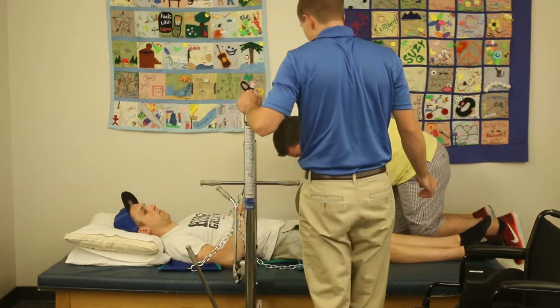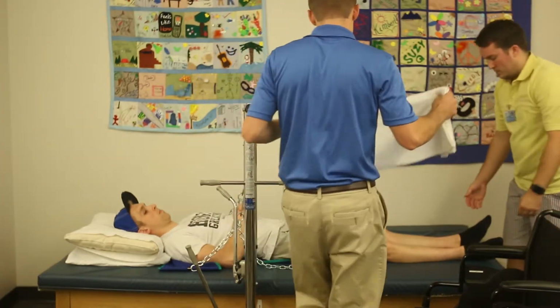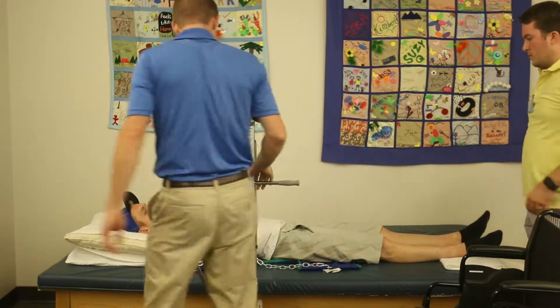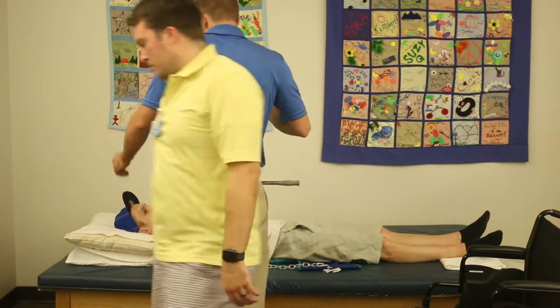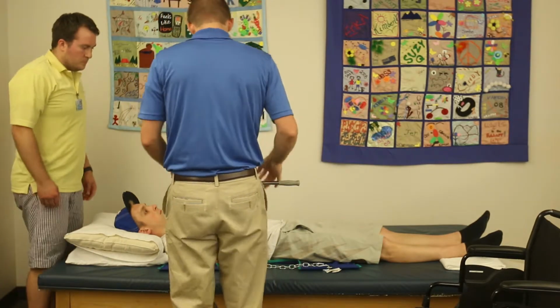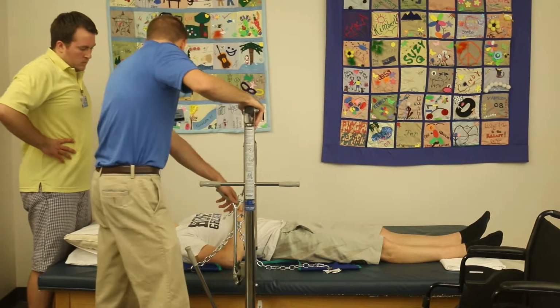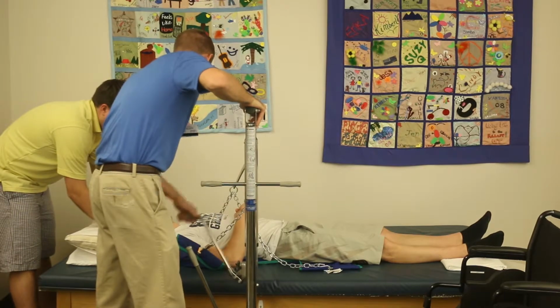We don't have your shoes on right now, so I'm gonna get a towel to put underneath your feet. So as we get you up, you're not gonna have any pressure on the heels, and they'll just slide on the table right there. And then as we get you over, we'll get your shoes back on. Does that sound okay? So Rich, I'm gonna have you come stand behind him. As he comes up, I need you to support just the underside of his neck. Okay. So let's get you coming up. Make sure those are locked still. Good to go. Okay, you ready? Okay. You're just gonna start coming up slowly with me.